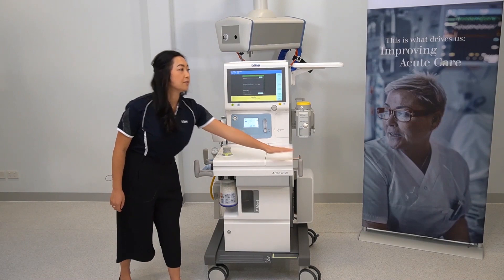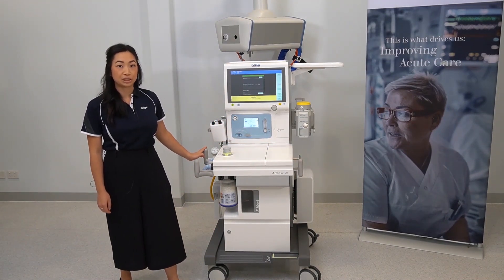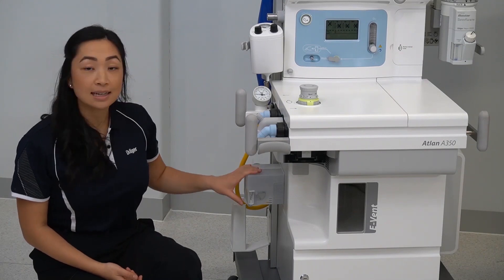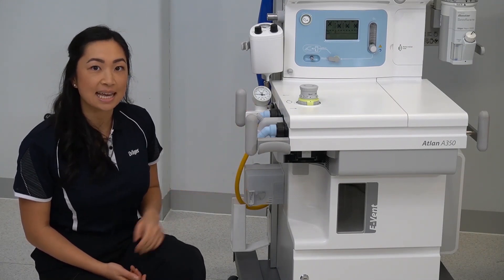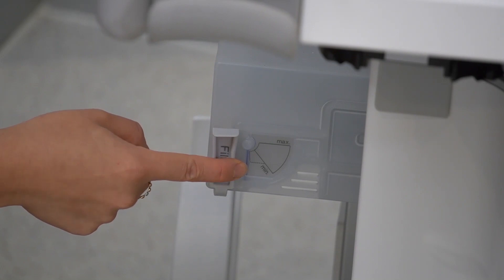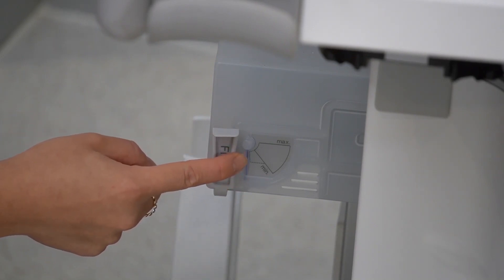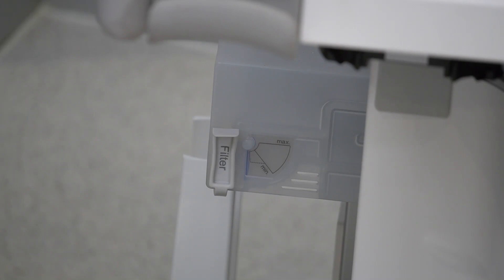On either side of the device are handles which should be used when moving the machine. Located to the side of the ATLAN, under the manual pressure gauge, is an anaesthetic gas scavenging system. When appropriately connected, the blue flap resting against this back wall will be floating between the min and the max lines, indicating adequate scavenging levels.